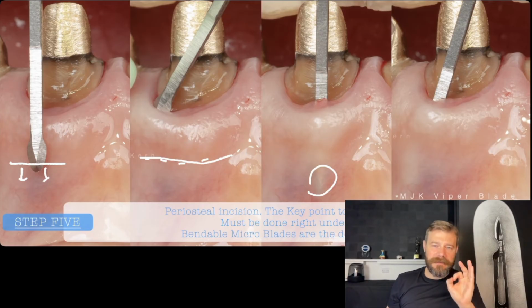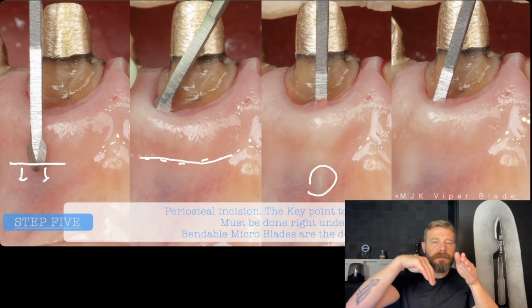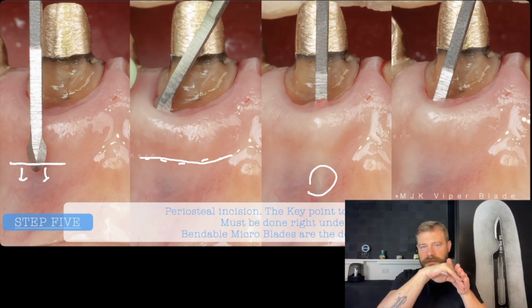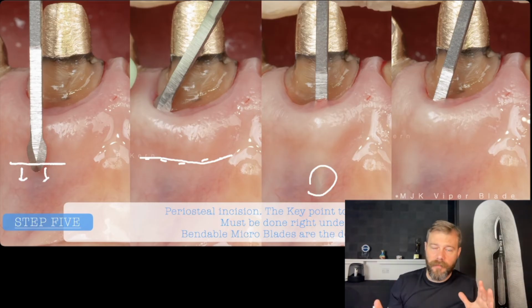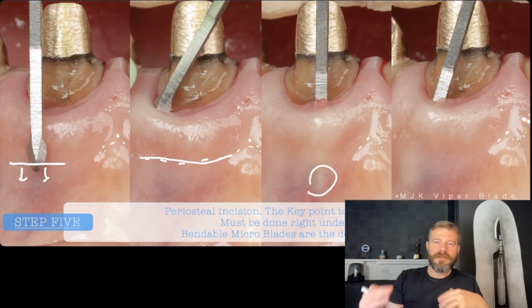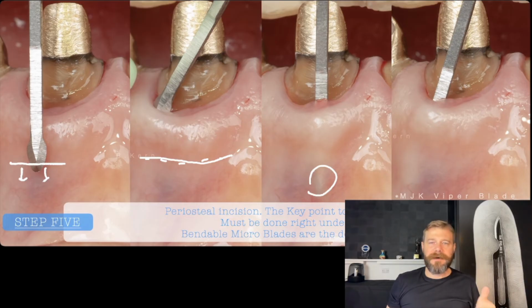A clean work with the blade here is not between the muscles. A clean work with the blade is on the surface of the muscles. Okay, that is very important. I keep repeating myself in every lecture or every small clinical case presentation about this. If you make this incision between the muscles, you're going to have more bleeding. You're going to have a worse post-op for your patient.